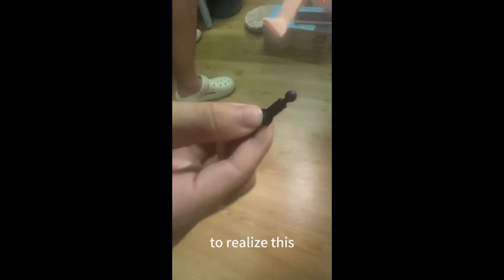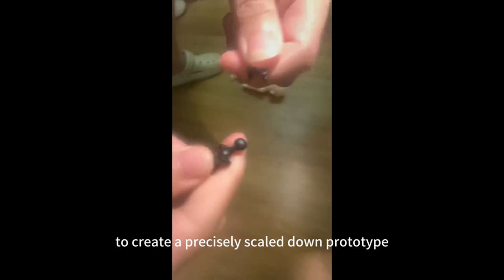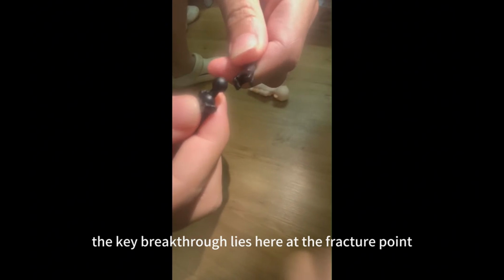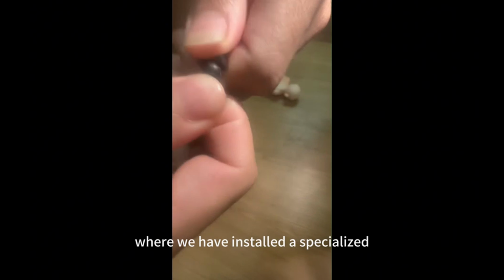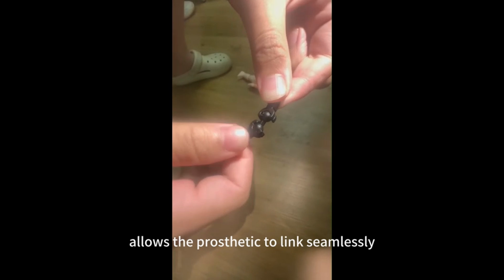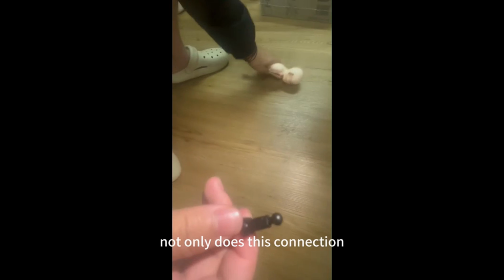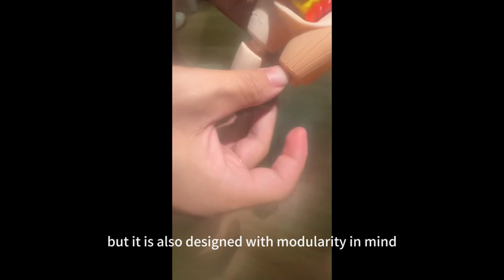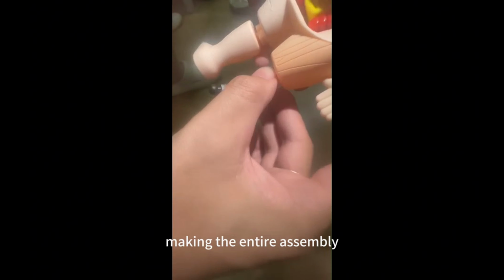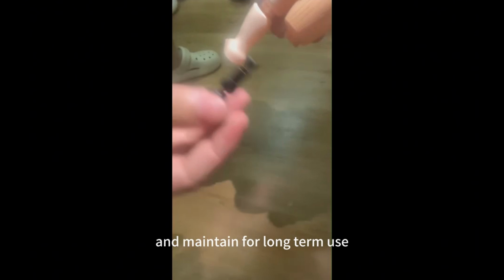To realize this, we used 3D printing technology to create a precisely scaled-down prototype. The key breakthrough lies here at the fracture point, where we have installed a specialized nesting structure. This unique mechanism allows the prosthetic to link seamlessly with the main body. Not only does this connection provide a much higher degree of flexibility, but it is also designed with modularity in mind, making the entire assembly incredibly easy to disassemble and maintain for long-term use.